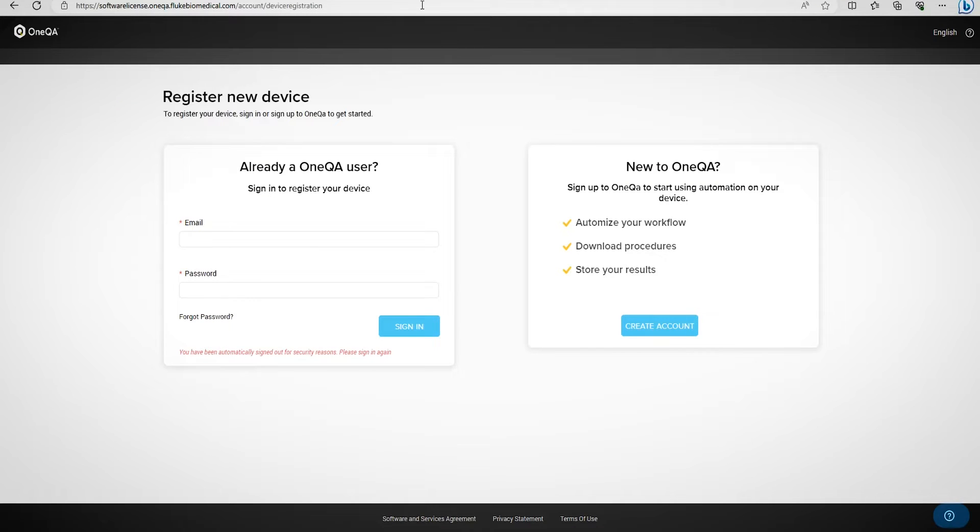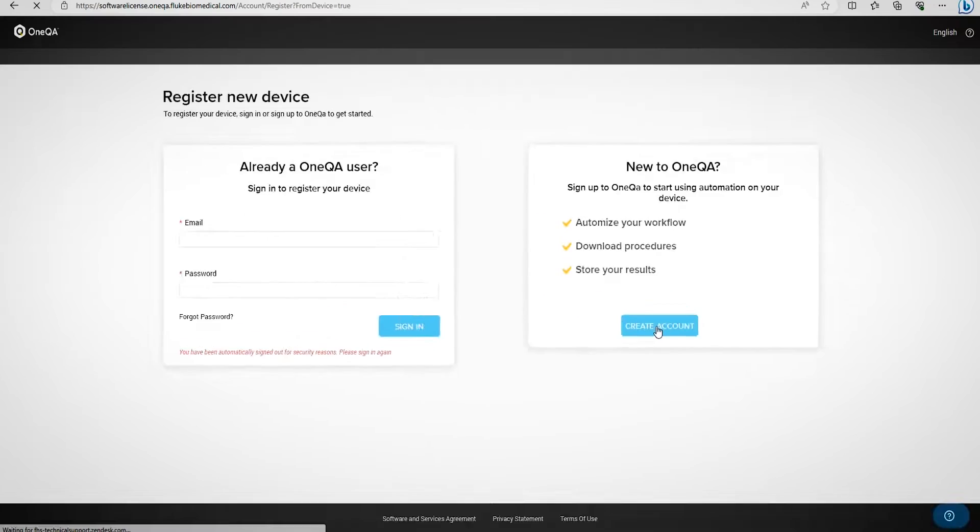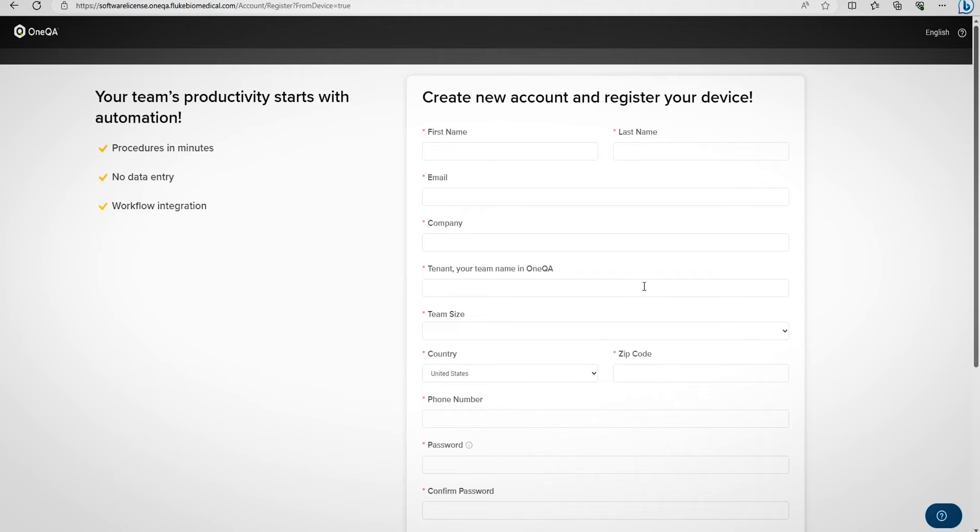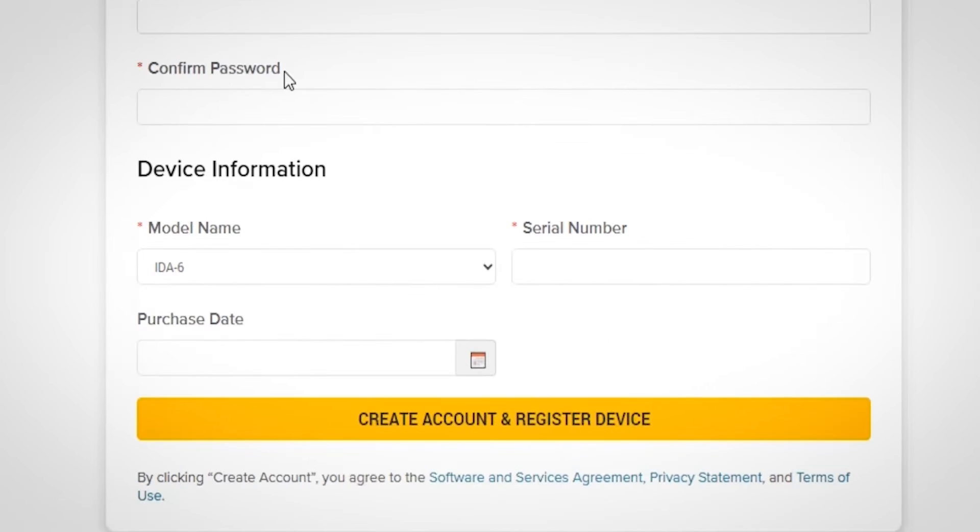Today, as new OneQA users, we will select create an account. Here is where you should enter your personal information, create your password, and input your IDA6 serial number and purchase date.